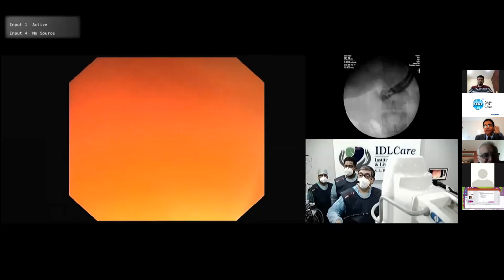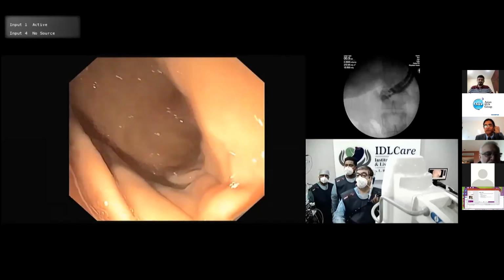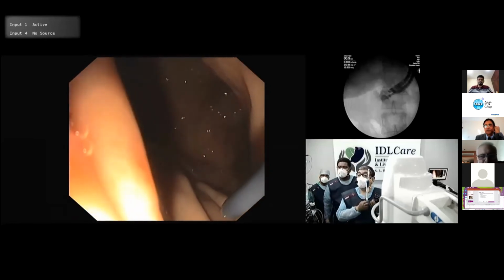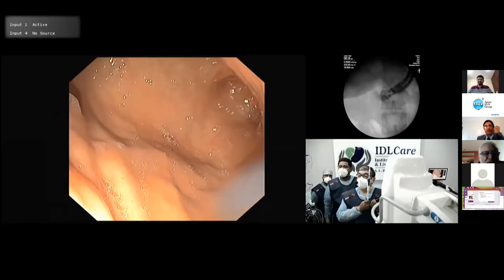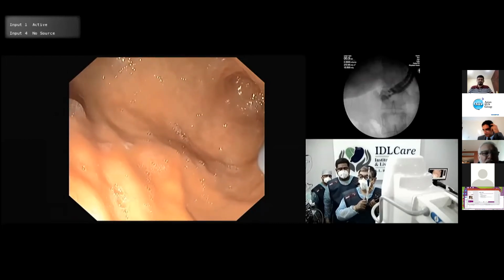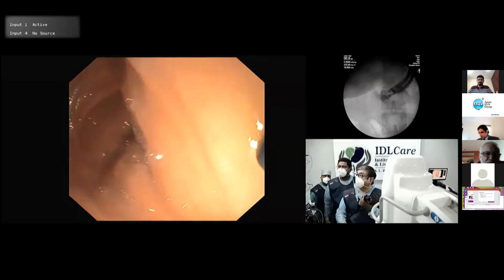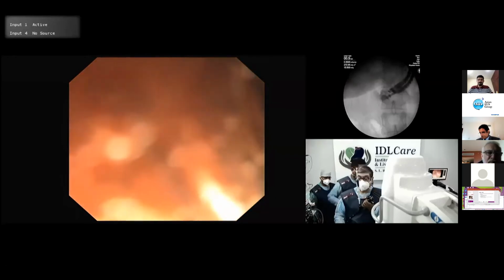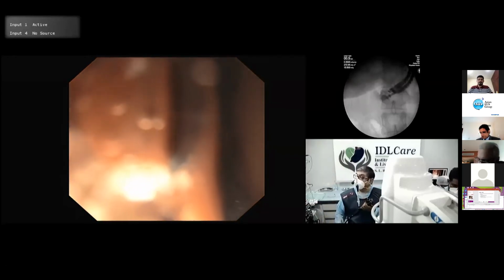Give inflate. Yes, see, you're in a wrong position. Let's go back. Needle too much out. Let's take the needle little in. This is good. So we suck the air, turn clockwise. Can you turn her left lateral? So we are again turning her back to left lateral. I am hoping that we'll get a better position.